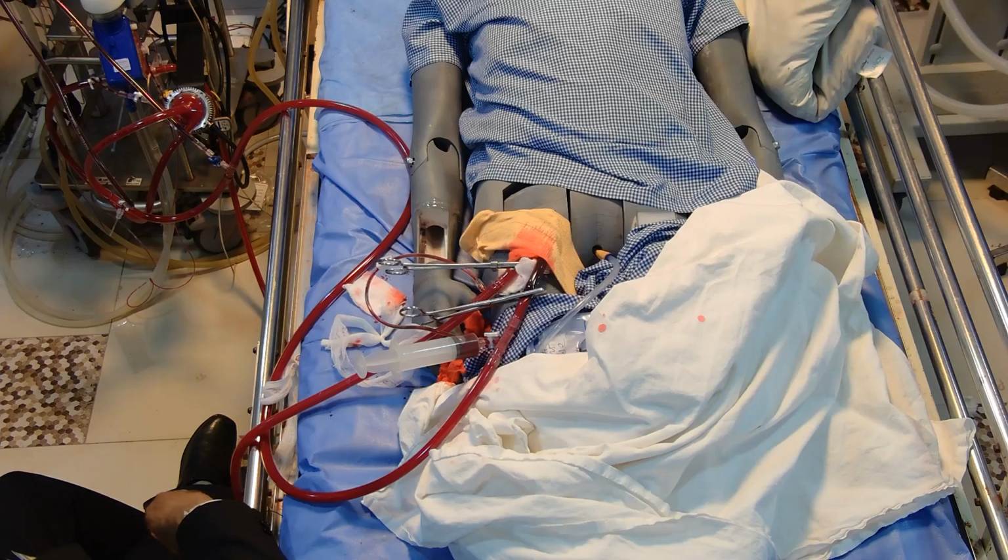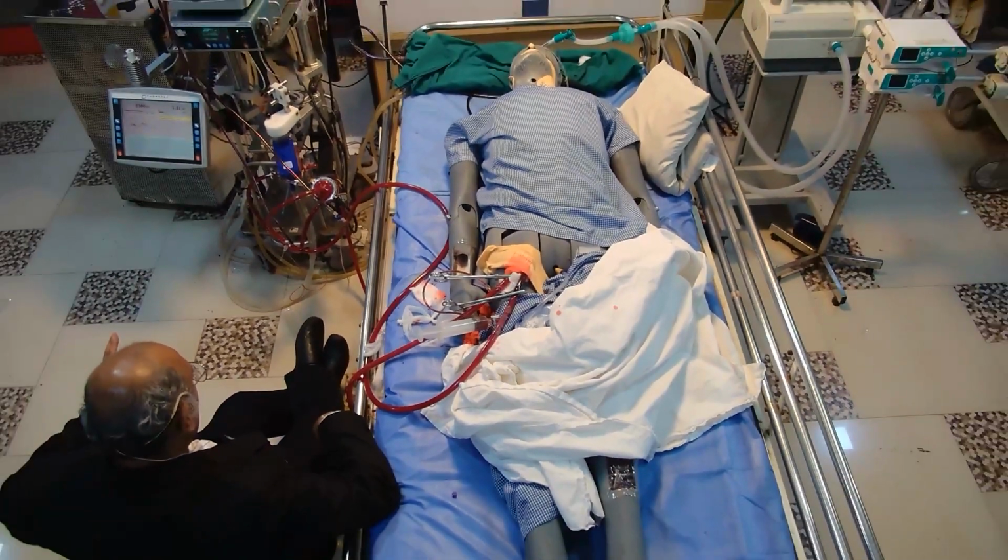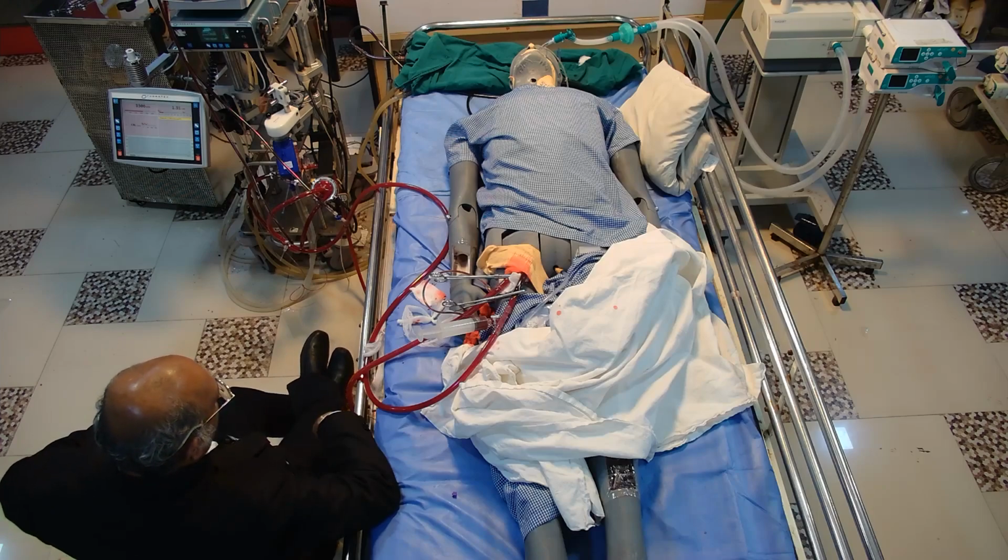You have to call the surgeon and get an appointment, get the time, what time you can decannulate. Now, suppose that decannulation is not possible immediately. What you can do is, you can always go back on the ECMO flow, say around 2 liters of flow, and maintain the patient on ECMO. And then when the surgical team comes, you can take the patient for decannulation.